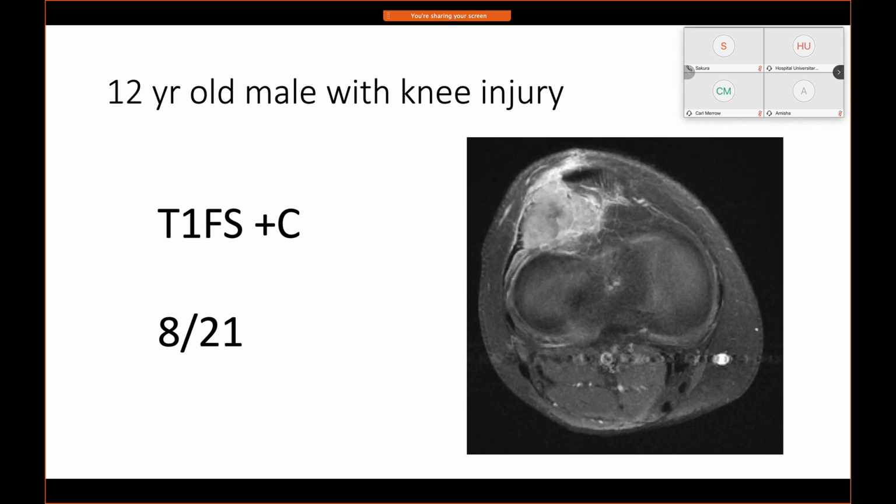And so I think the message behind this case, it's not that it was missed initially, is that when you see something funny, particularly about the extremities, soft tissue, if it's about the joint, and it's a young person, that should always be in the back of your mind. Could this be a synovial cell sarcoma? Sometimes I've seen cases in the hands and feet where it looks like purely a tiny cystic something, and then for all practical purposes, it looks like something benign if you saw it in an adult, in an older person. But when they're younger, when they're adolescent, synovial cell sarcoma should always be in the back of your mind. And if there's any doubt, I give contrast and I have a short interval follow-up.